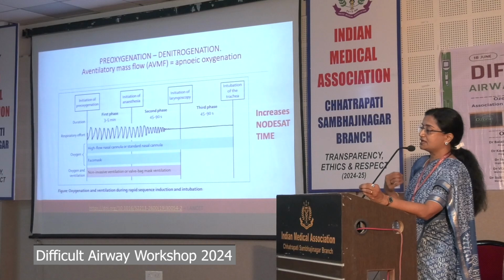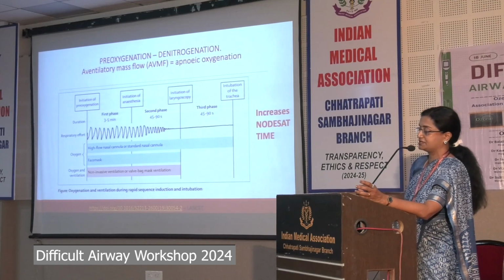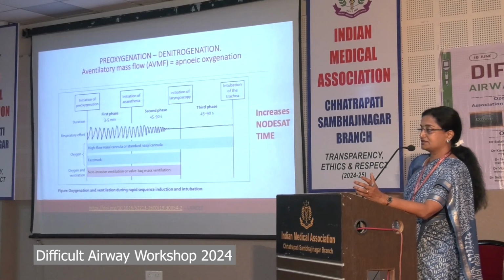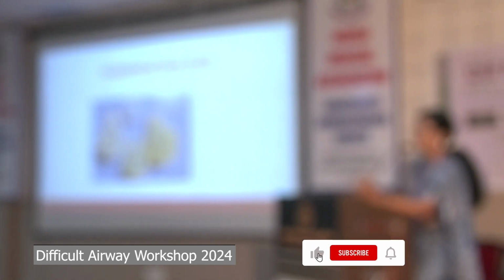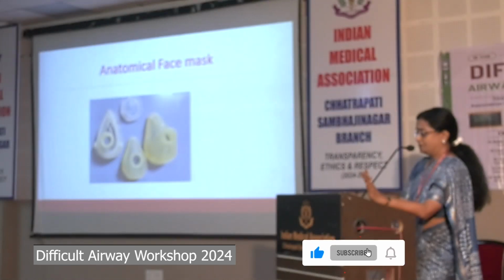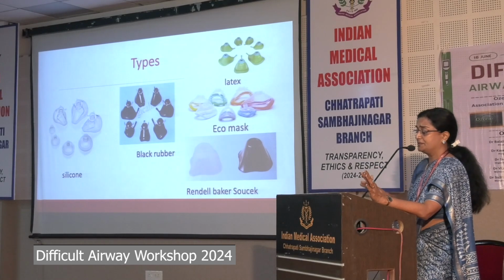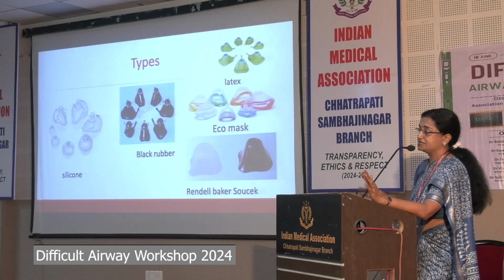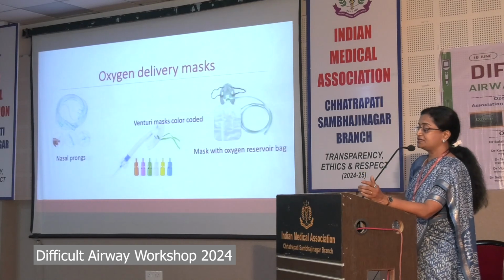In 90% of cases, I'm rarely masking my patient. I have not used a bag mask since COVID time, giving high flow nasal oxygen and apneic insufflation till my tube is in place. These are various anatomical face masks. See which you prefer, and according to the patient, pediatric, edentulous, or obese patients, which fits, and you have to keep them ready. Oxygen delivery mask.